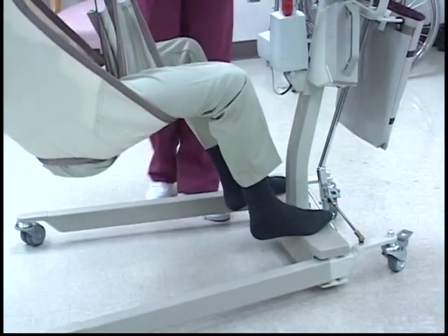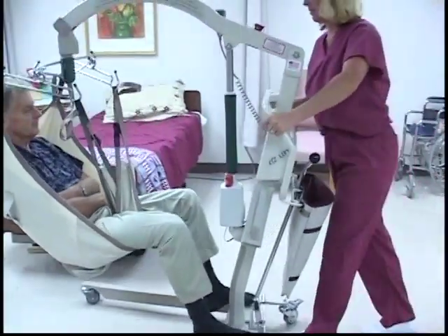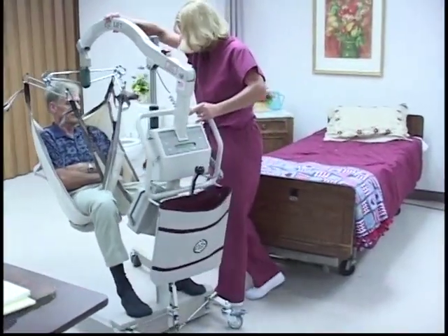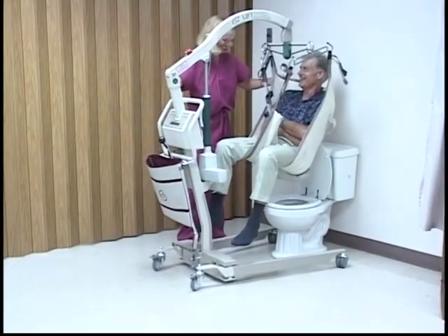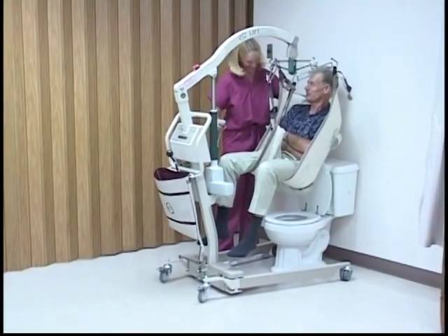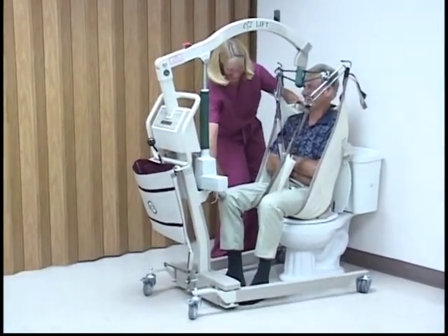When using the Easy Lift for transferring patients, lower the patients so that their feet are resting on the base. This will make the lift control and turn more easily and give the patient a greater feeling of security. Easy-Way slings are designed for easy toileting. After the patient has been transported to the bathroom, position the lift around the toilet and lower the patient.